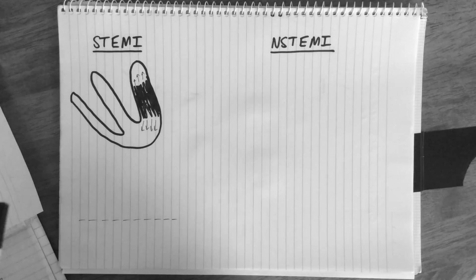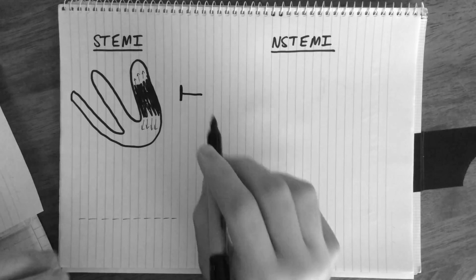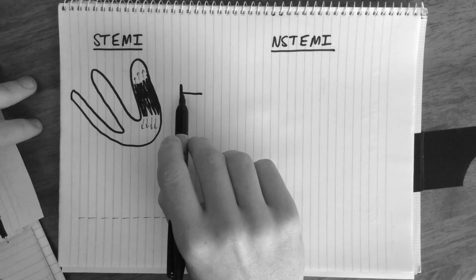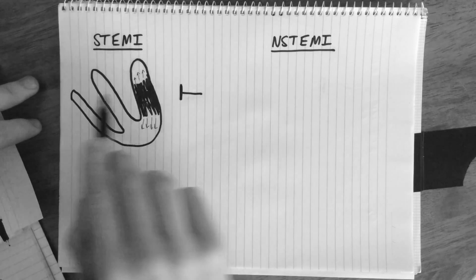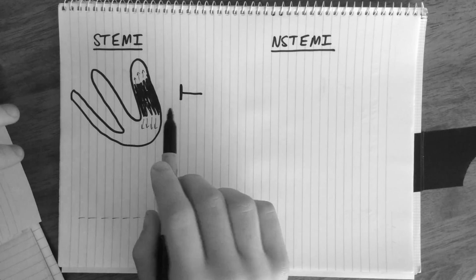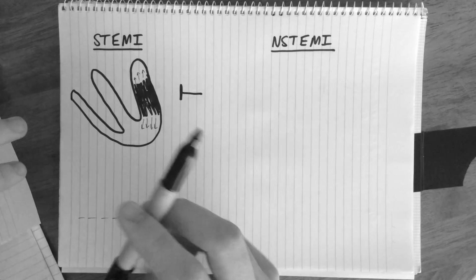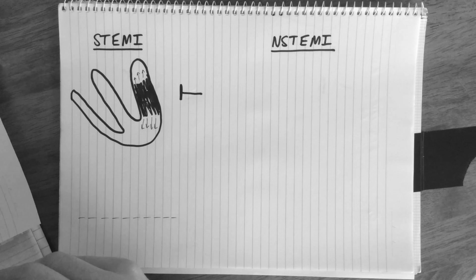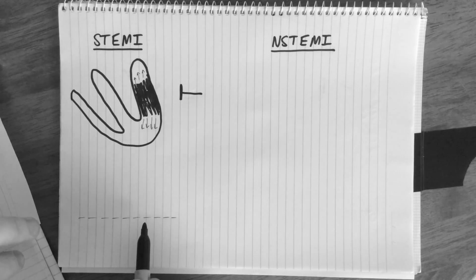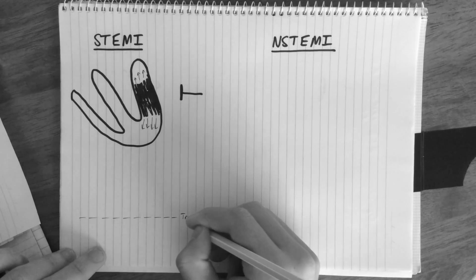When we do an ECG, we place leads around the chest, and the leads will record the movement of current in a specific plane. So for instance, I put an electrode of a lead here, and it will record current that travels towards it or away from it. To measure the baseline, the electrode records any movement of current prior to the spontaneous depolarization of the SA node. Normally, this will be 0, and we'll see an isoelectric baseline. So this would be normal. This is a true baseline.